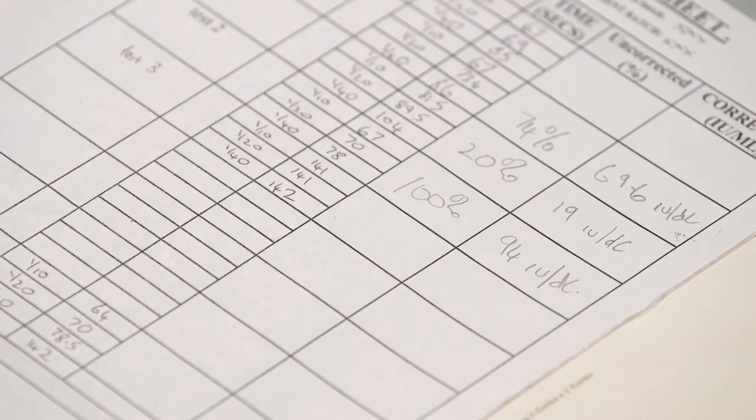So we didn't meet all the criteria for a valid assay. There is interference. I think we're safe because these two show a straight line parallel to the standard, and it's clear that this has a normal concentration of factor VIII.